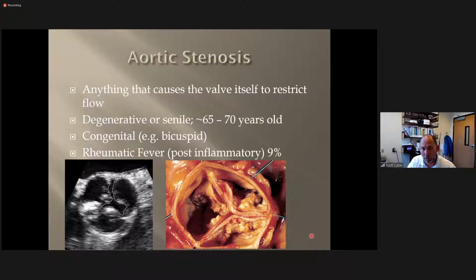So when we report on the aortic valve numbers, I always want to see you report it as an AVA, or aortic valve area. Yes, I want the maximum velocity. Yes, I want the TVI going through the LVOT. I want the LVOT diameter, but the number I'm most interested in is the aortic valve area. Likewise for the doctor, they'll also want mean pressure gradients and stuff like that that come from the TVIs.